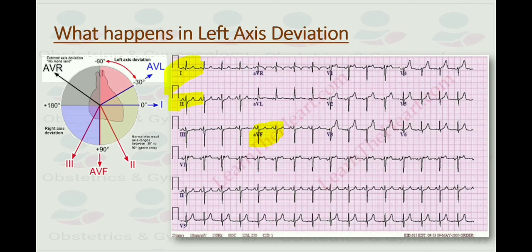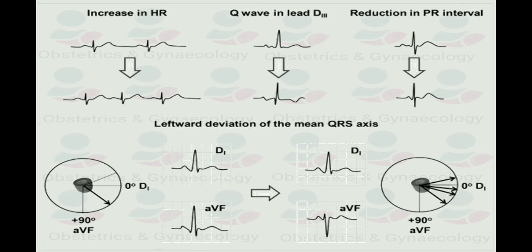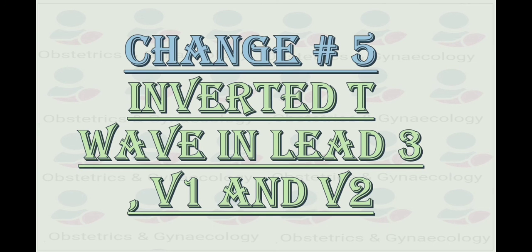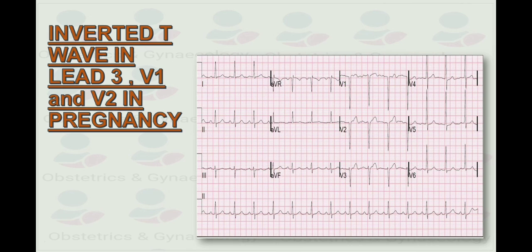This is a summary of whatever changes take place in pregnancy. There is an increase in heart rate, Q wave in lead 3, reduction in PR interval and leftward deviation of the mean QRS axis. Let's discuss change number 5, the inverted T wave in lead 3, V1 and V2. In this ECG, you can see inverted T waves in lead 3, V1 and V2, which occurs normally in pregnancy. But in normal ECG, you will not come across inverted T wave in lead 3.